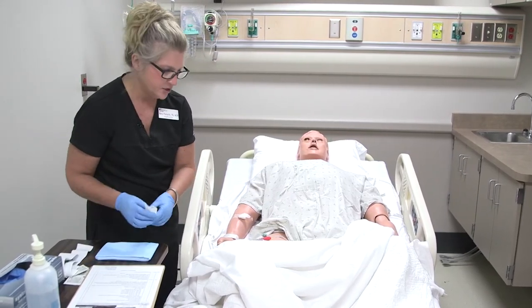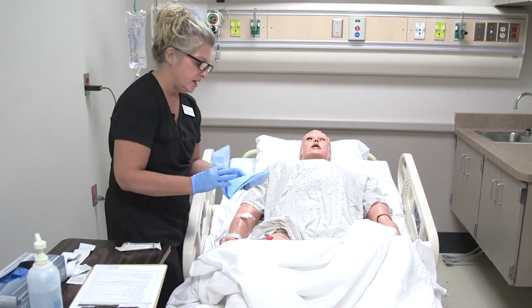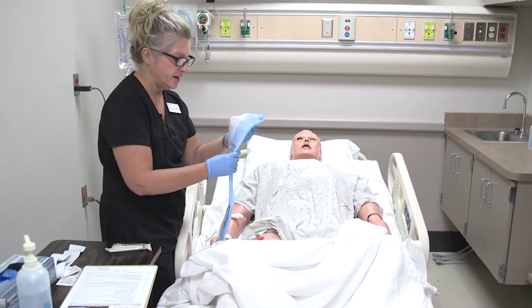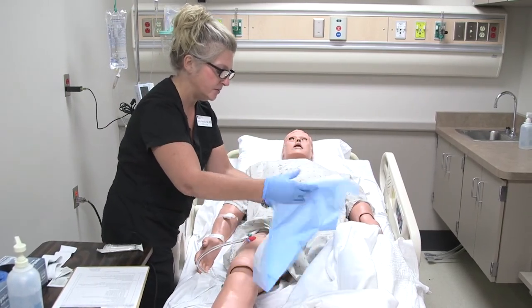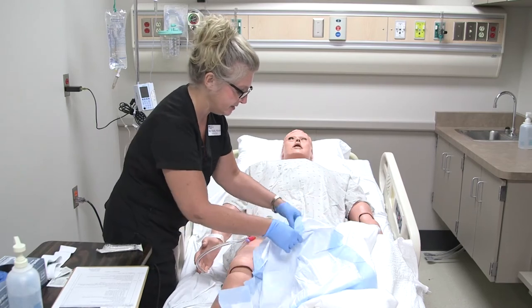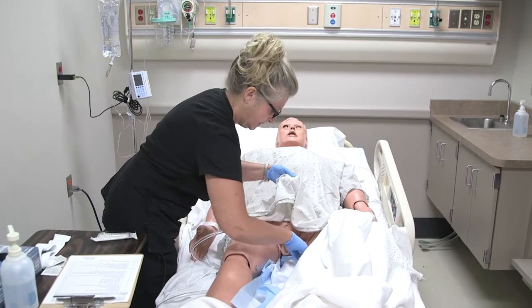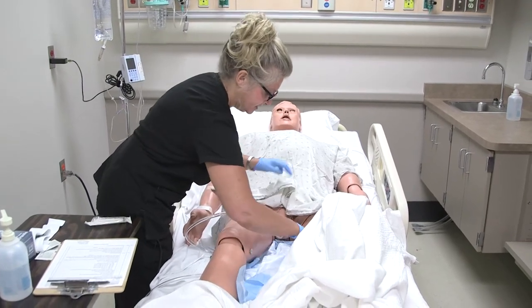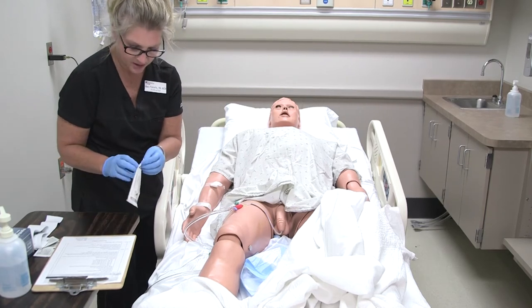The only equipment that you really need is a 10 cc syringe. If they don't already have a pad underneath, you can go ahead and put a pad just in case, as you pull it out, there might be some leakage of urine. I'm just going to put this underneath here real quick, just to catch if you have anything. And then I have my syringe.